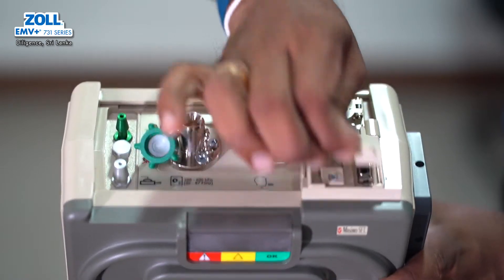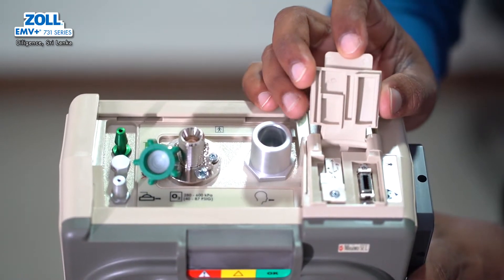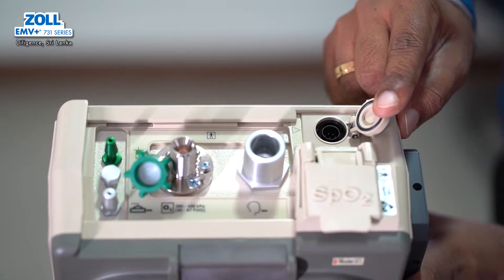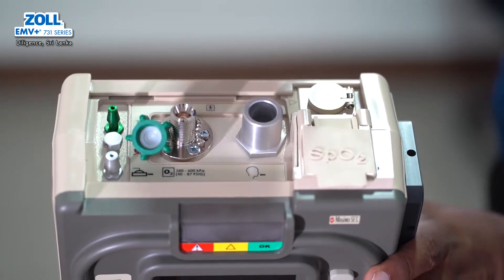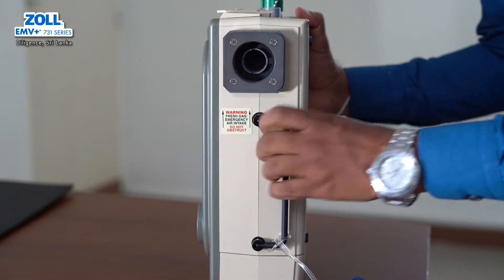This is the cover of the SPO2 probe. You can connect the probe to the tube. Then you can connect the power supply. You can connect AC voltage and DC voltage. You can connect the charger with AC voltage.